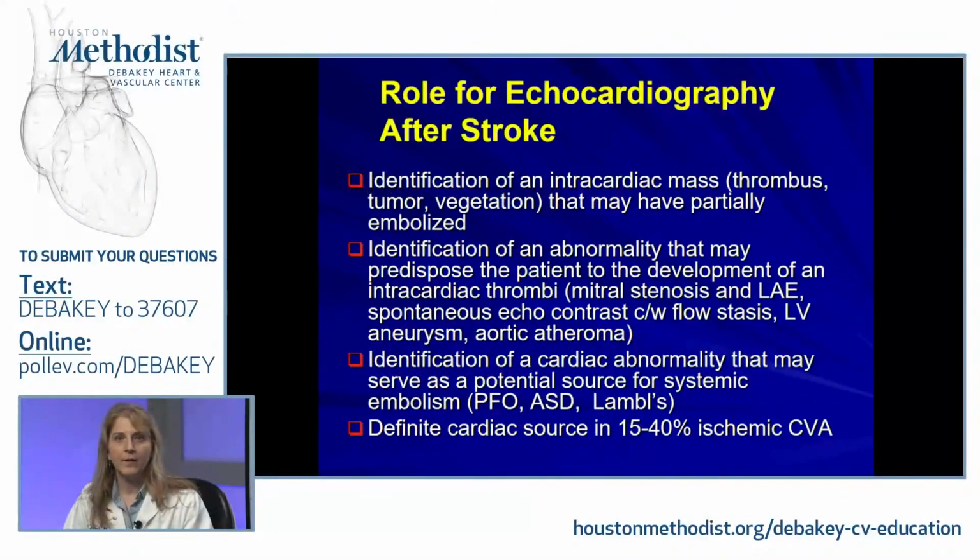So what is the role for echocardiography after stroke, so in cardiac source of embolus? Well, the role is to identify whether or not an intracardiac mass is present, such as a thrombus, a tumor, or vegetation that may have partially embolized, so that there may be a part of it still left when you do TEE.